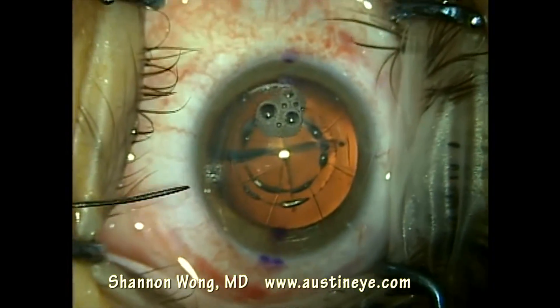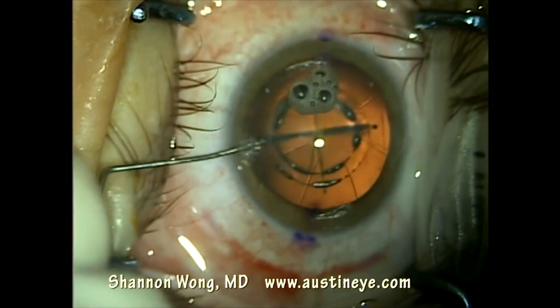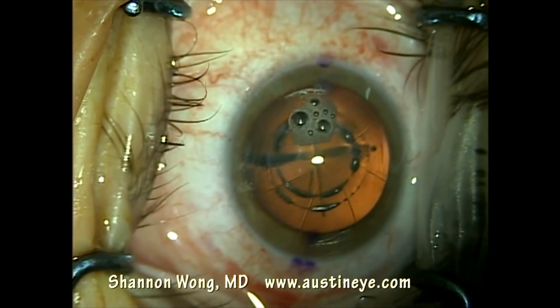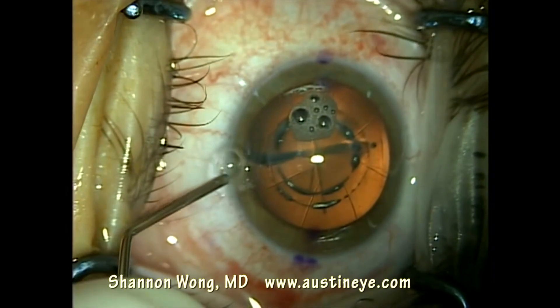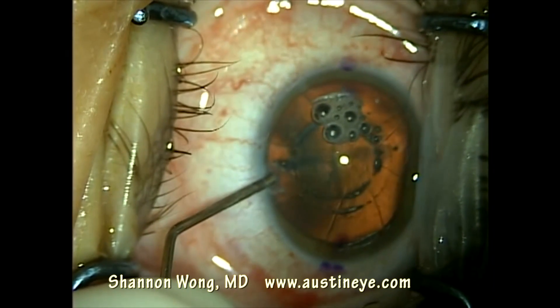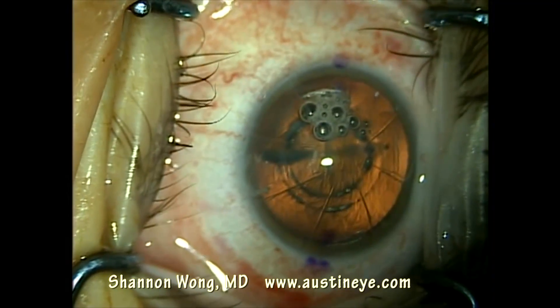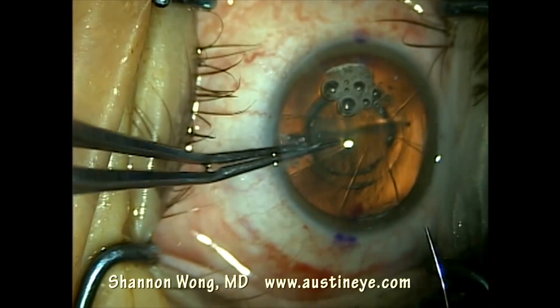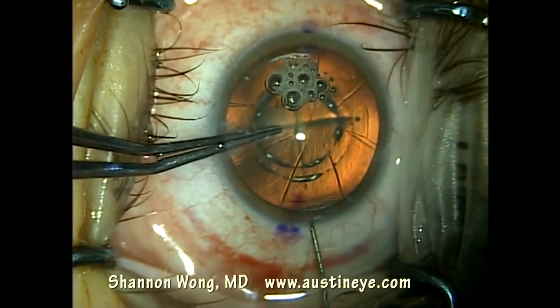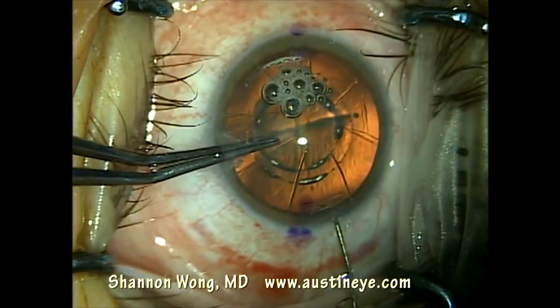We've taken the patient back to the operating room. We coat the cornea with Ocucoat viscoelastic. I use a cyclodialysis spatula to open the secondary incision, and then use Ocucoat to fill the anterior chamber. I use smooth tying forceps to stabilize the eye as I open the primary incision again with a cyclodialysis spatula.